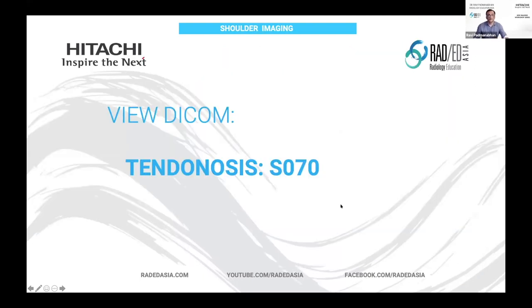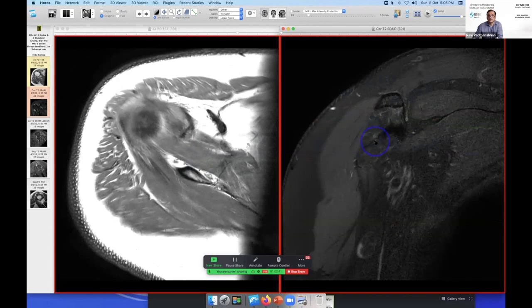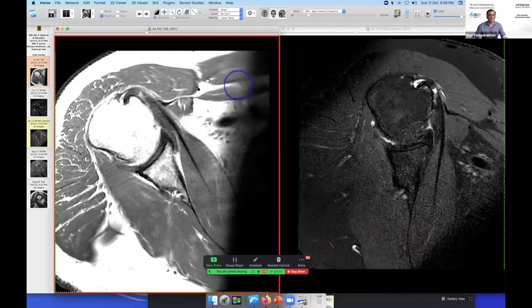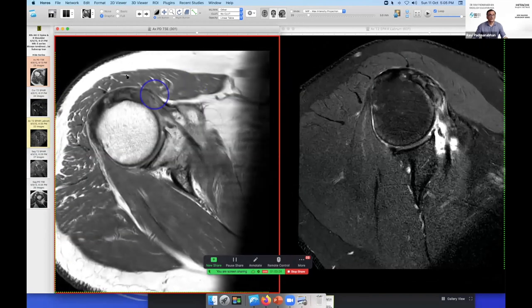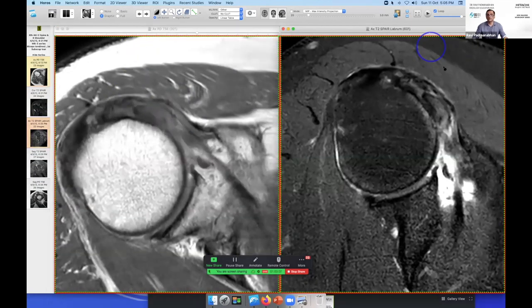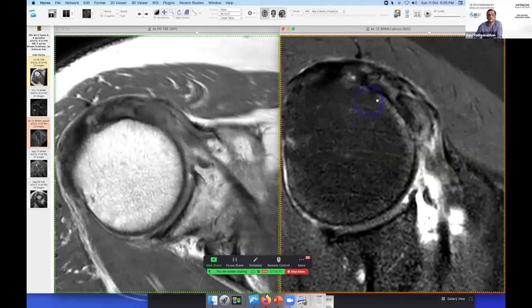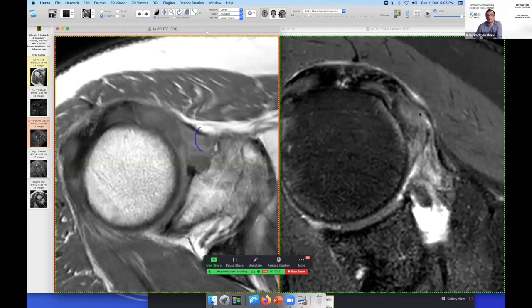Let's look at a couple of cases. This scan has a very typical appearance of severe tendinosis. We're going to look at the portion where the tendon goes between being intra- and extra-articular, and as I said, that's a very common spot to get tendinosis. Here's the biceps tendon at the intra-articular portion — it's hyperintense. Remember, it should be black.